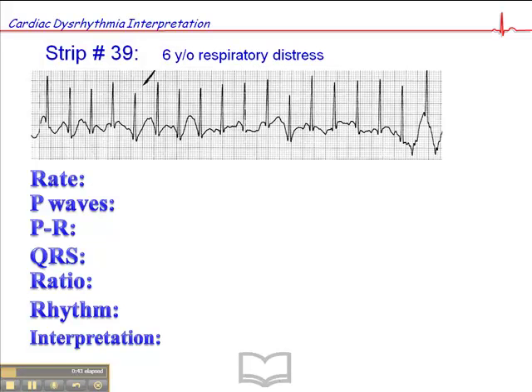Let's look at some of the key areas here. The heart rate is about 150. This is a distressed six-year-old child. Now that's high, but not alarmingly high. In a six-year-old, we'd be worried if we saw the heart rate above 180 — that's when we start to think about the possibility of supraventricular tachycardia versus sinus tachycardia.